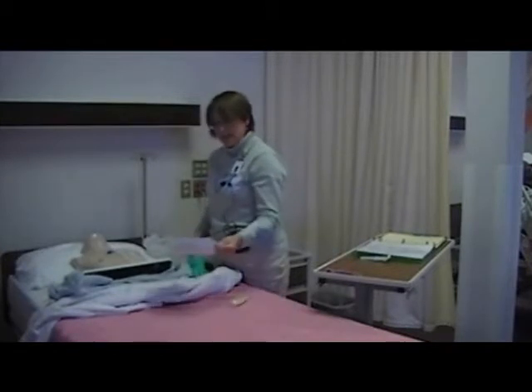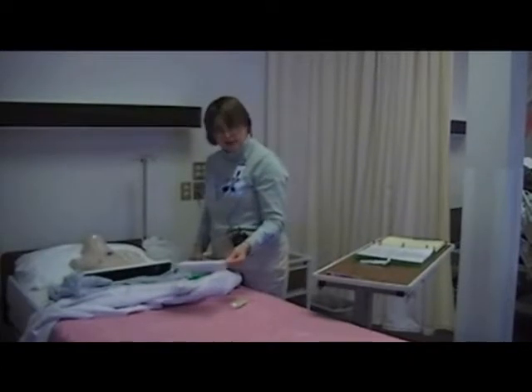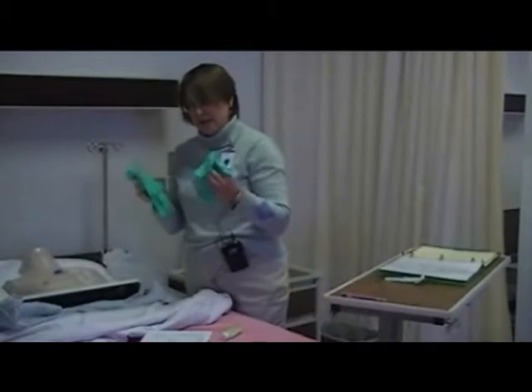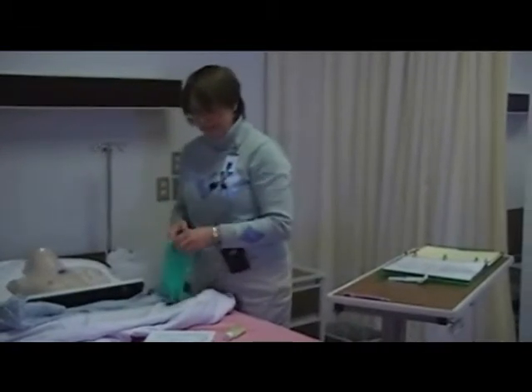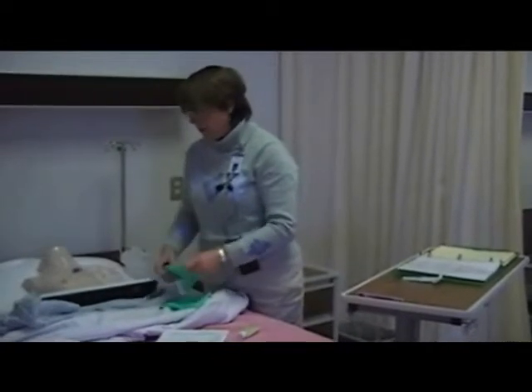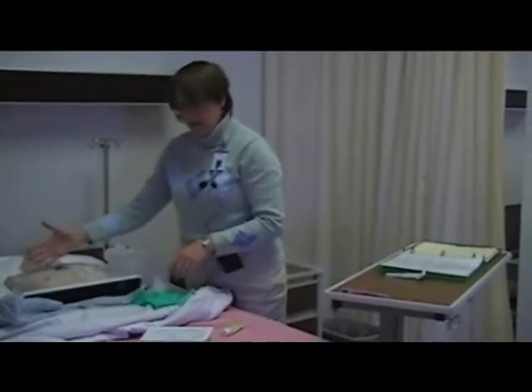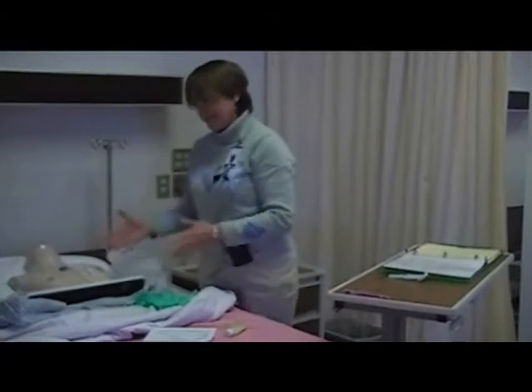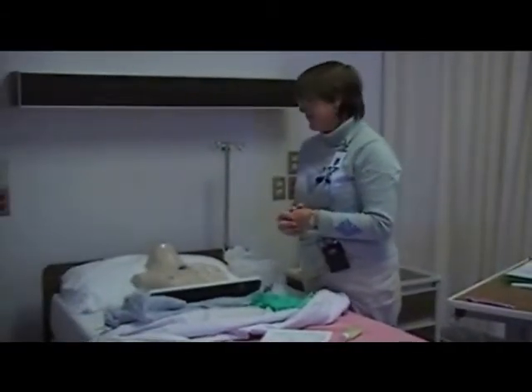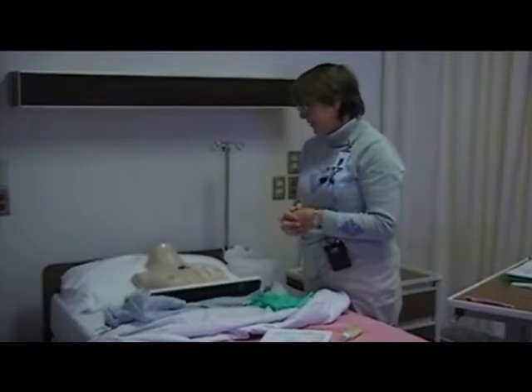And I want to make sure that he's not allergic to anything that is in my kit. This is a latex-free kit. I want to make sure that my clean gloves are also latex-free if he's allergic to latex. And I'll make sure he's not allergic to the bio-occlusive dressing that will be used or any of the preps, such as the ChloraPrep. He says no problem before. He's had it changed several times. It's doing fine, doesn't cause him any troubles.